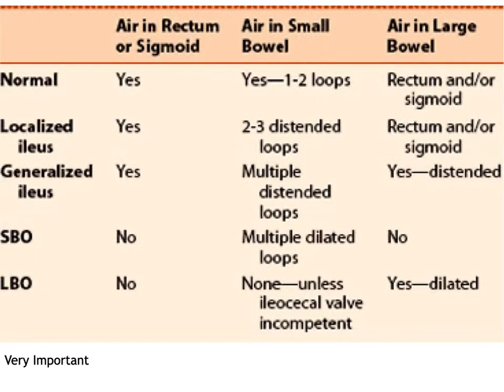What is very important to know? You have to be able to make the difference between ileus, paralytic ileus, and bowel obstruction, or mechanical obstruction. Paralytic ileus and bowel obstruction, mechanical obstruction, please. So, you remember we have three views.